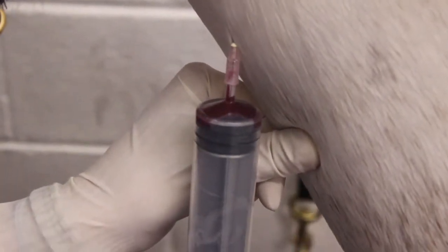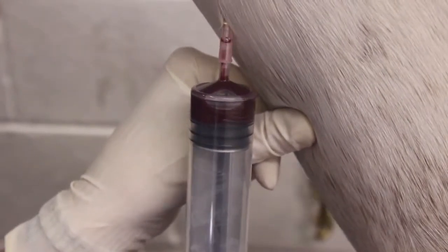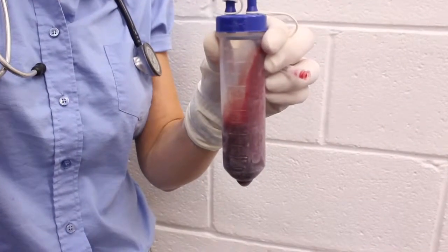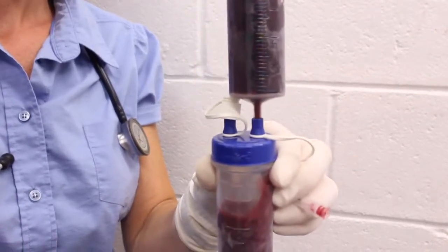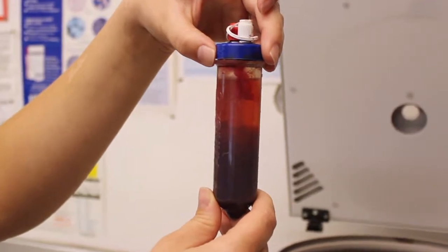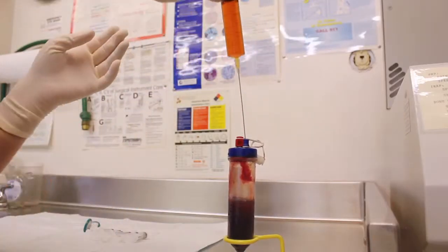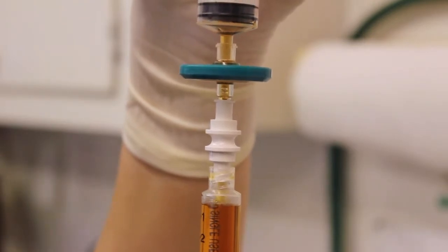The IRAP procedure involves sterile prep of the horse's neck and a blood draw. We draw the blood into a 60 cc syringe and immediately transfer that blood into a container containing the magical beads, as some people call it. That product is spun down and incubated overnight, then sterilely drawn up into various syringes depending on the volumes you feel like injecting.